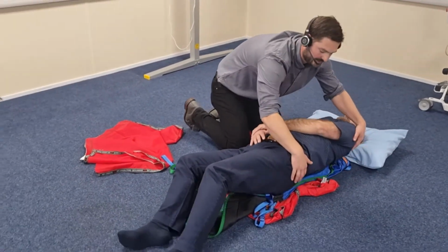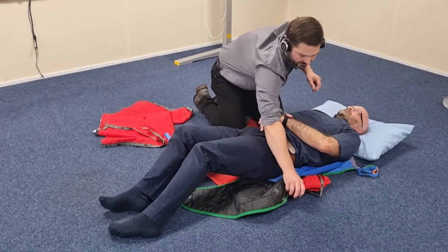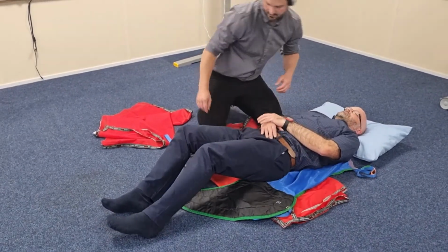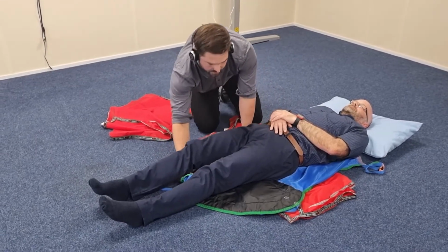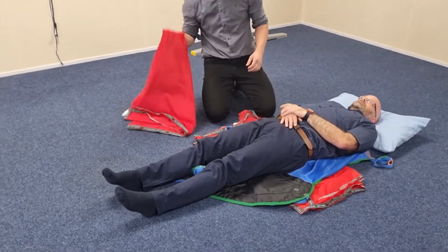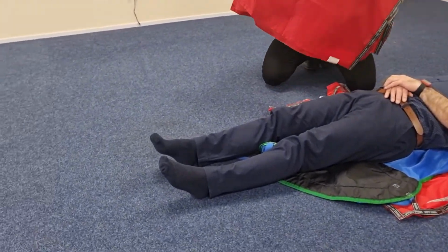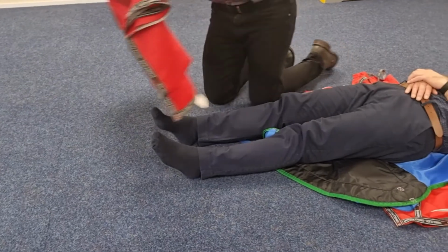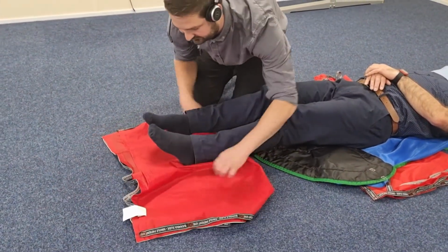And then we might have to do a slight roll to this side just to bring the material of the sling and the slide sheet through. And just straighten it out. I'm then going to introduce the second slide sheet. This one's going to be positioned underneath the person's heels. Again, just creating that barrier between them and the static surface. There you go.